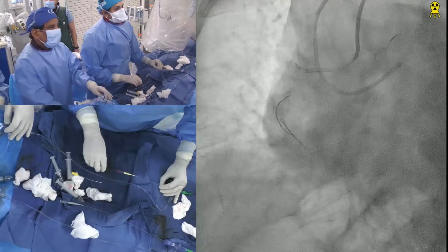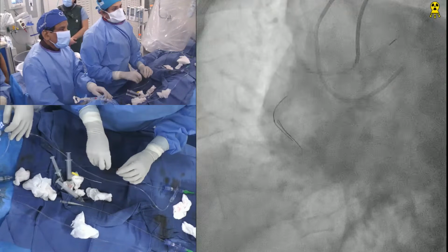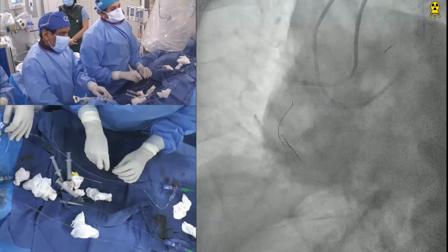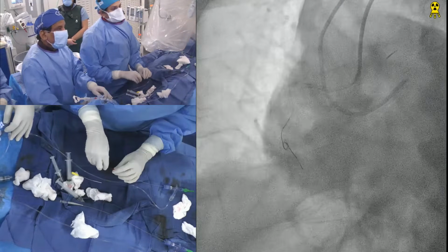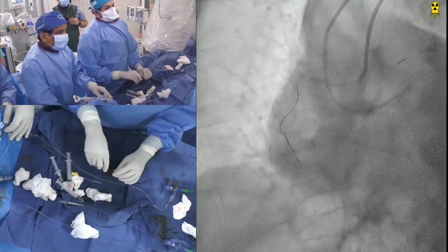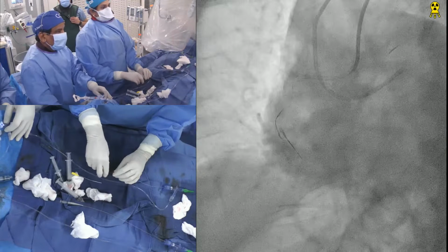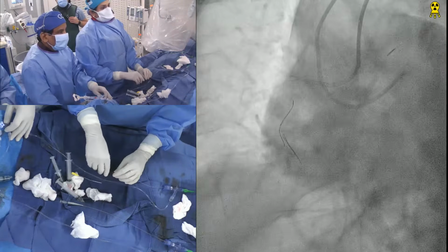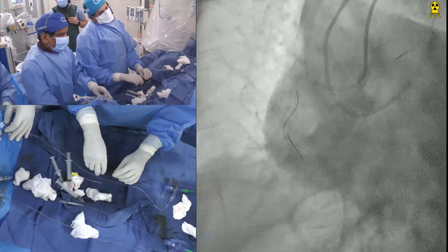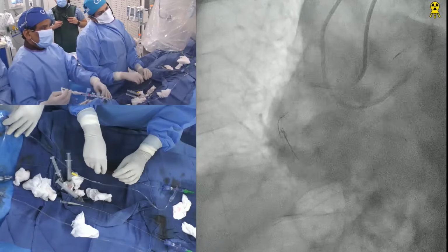So there are many other viewers still suggesting all sorts of wires. Tell us what are the other wire suggestions? Well, we had done all of them. They are suggesting going back to the Gaia for the antegrade. Not so sure. Right. And we've got Gaia. Get the Gayatri again. People joining us from Jakarta, Indonesia. Robert, welcome to you.